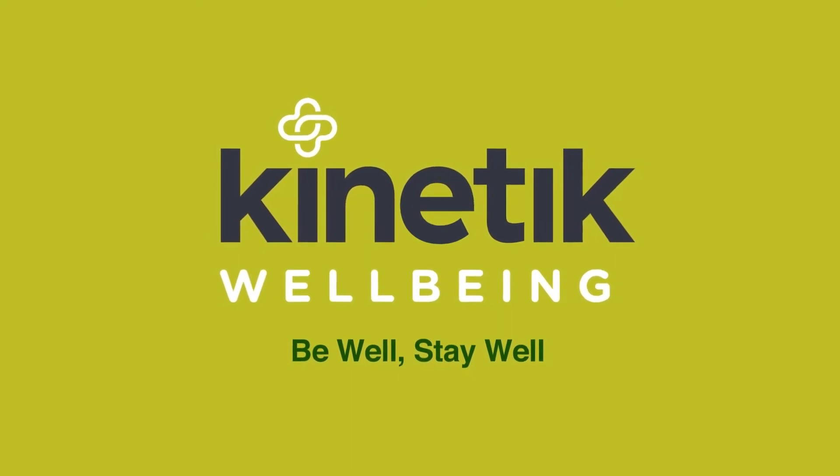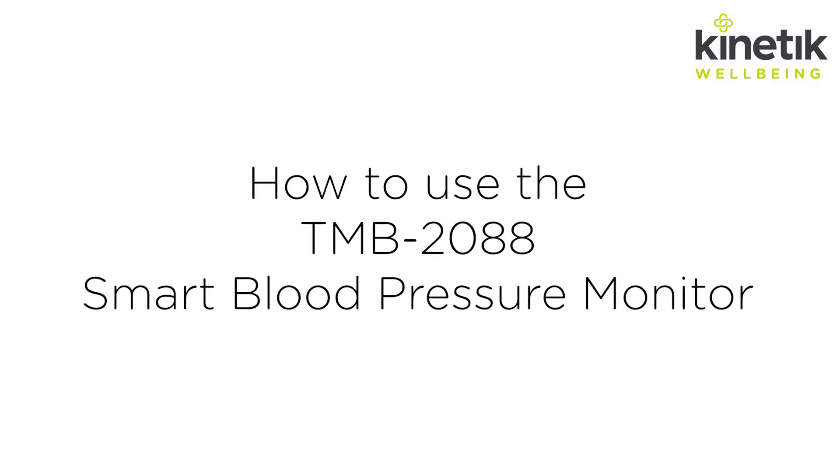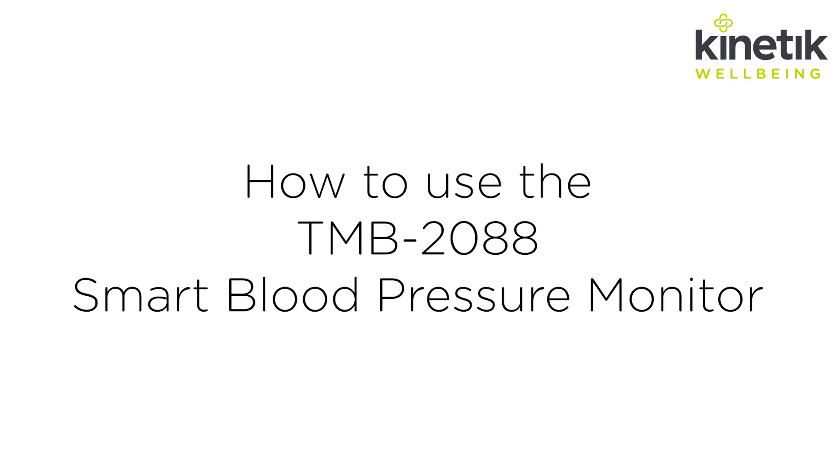Kinetic Wellbeing have developed a range of accurate, simple to use and affordable blood pressure monitors. Here we will show you how to use the TMB2088 smart blood pressure monitor.